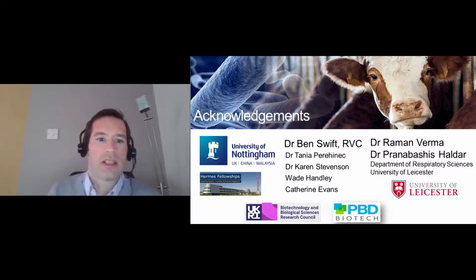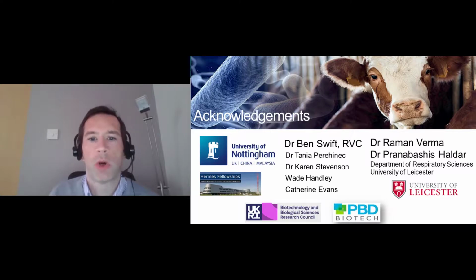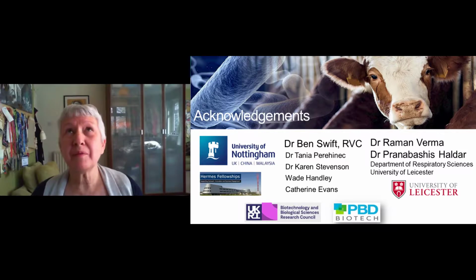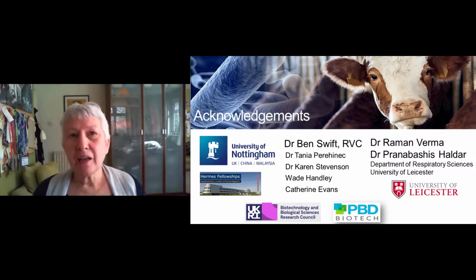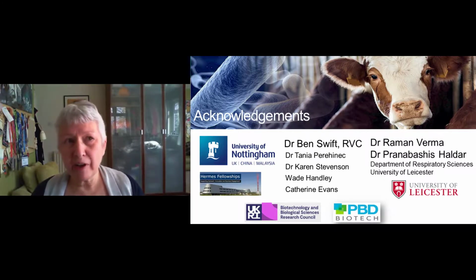One of the questions is, you mentioned testing milk samples. Have you tested and compared both pre and post pasteurized milk using this technique? Yes, we have indeed. We published a paper on this about 5 years ago now. When you look at pasteurized milk, in retail pasteurized milk, we could find low levels of MAP in about 10% of retail milk samples.